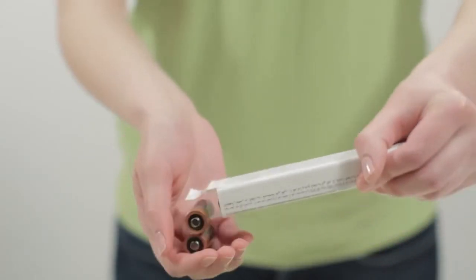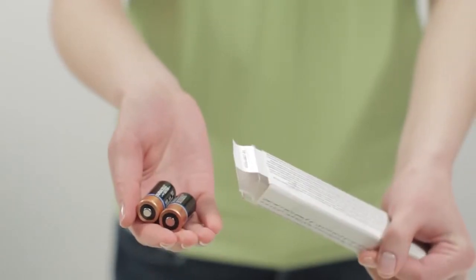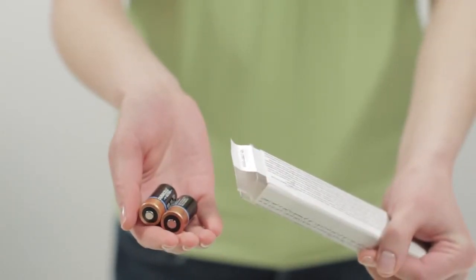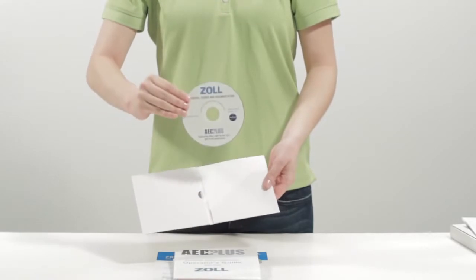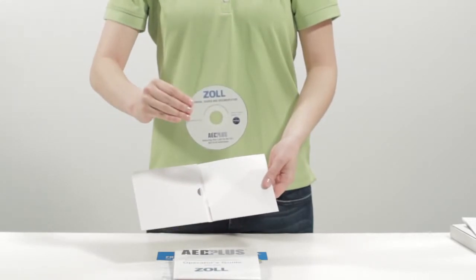If you ordered batteries with your AED Plus, you will find in the box a sleeve of 10 Duracell 123A lithium batteries. These are available at camera stores and other retail outlets. Replacement batteries don't have to be purchased directly from ZOLL. See your administrator's guide, located on the documentation CD, for a list of ZOLL's approved battery manufacturers.